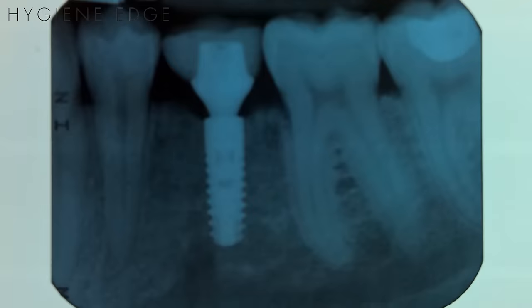Also, be sure to discuss with a dentist a protocol for your office to regularly evaluate implants with radiographs.